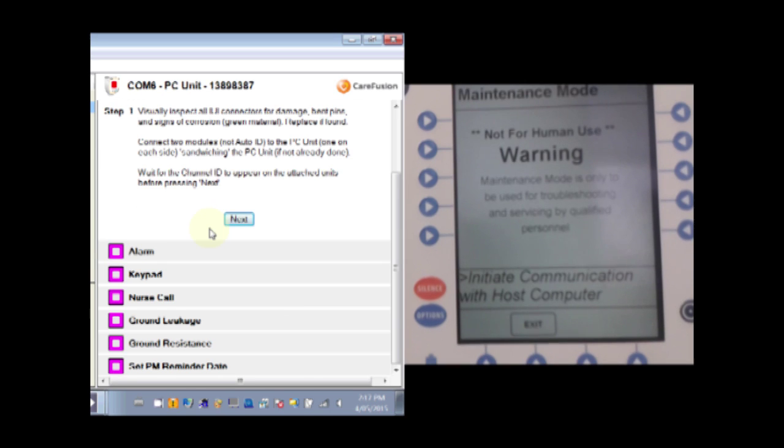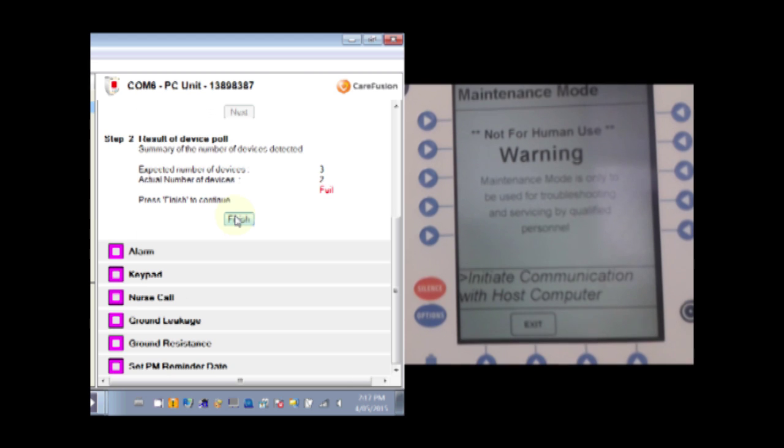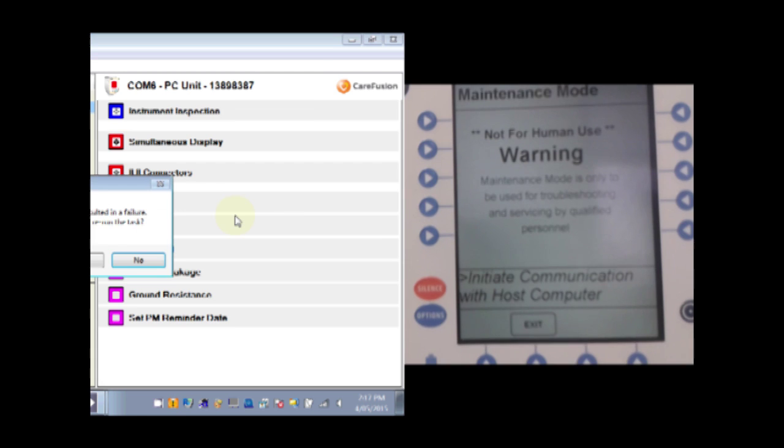But today I have only got the one pump module. So you can see we get a fail there but you get the general idea. You could have tested the other side.